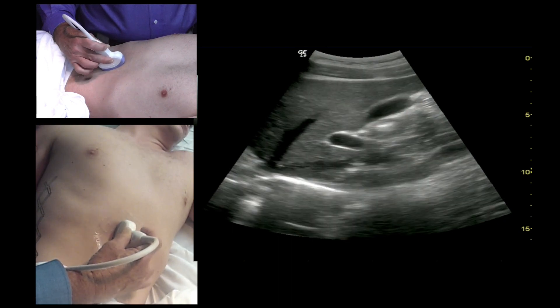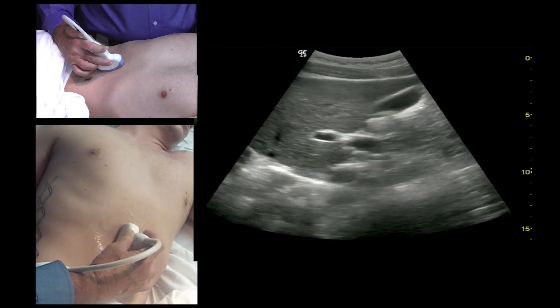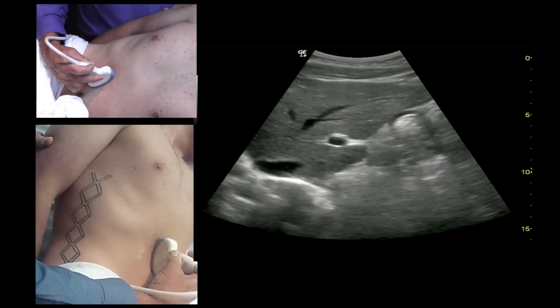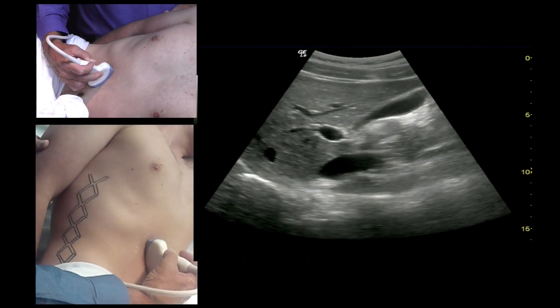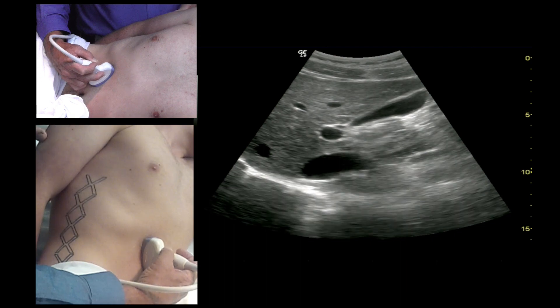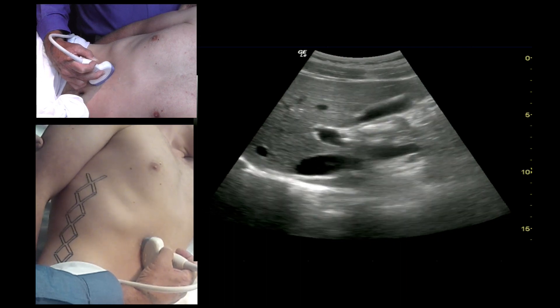Also if you're having trouble finding the gallbladder, you can roll the patient more into a left lateral decubitus position, which gets much of the gas out of the way, and you can have him take a deep breath and hold it, which pushes the gallbladder down toward your probe.